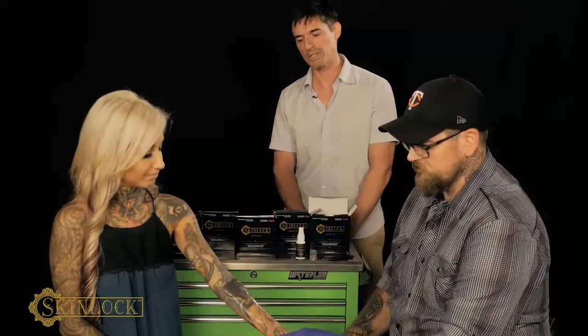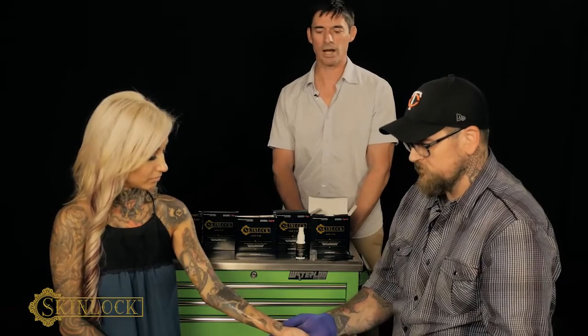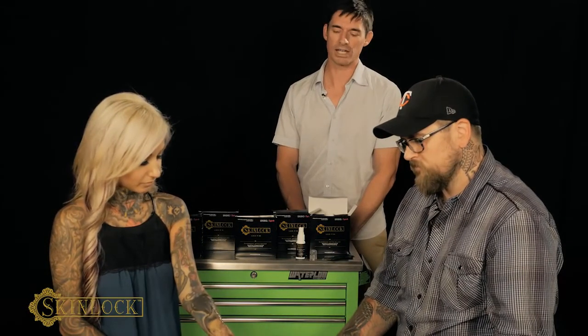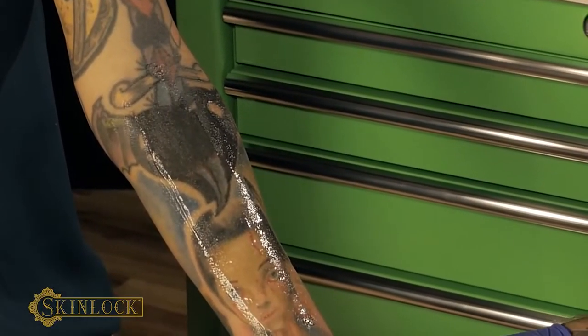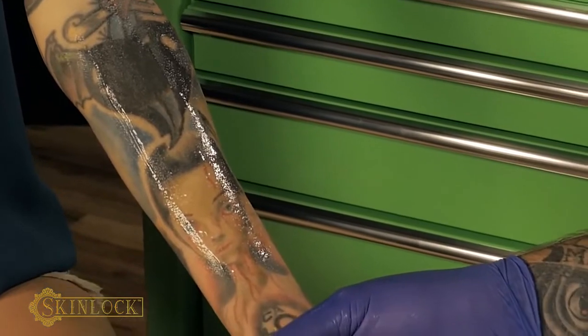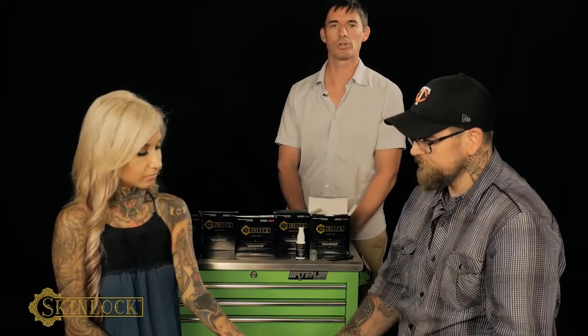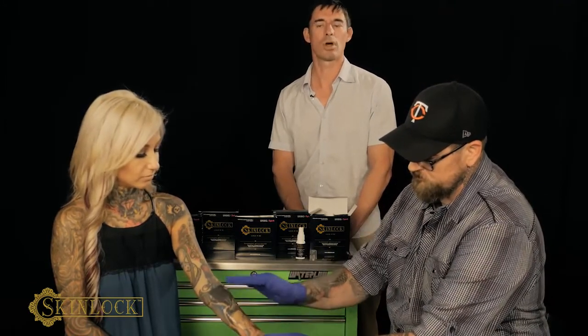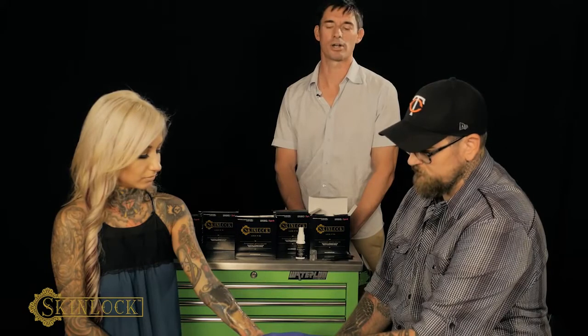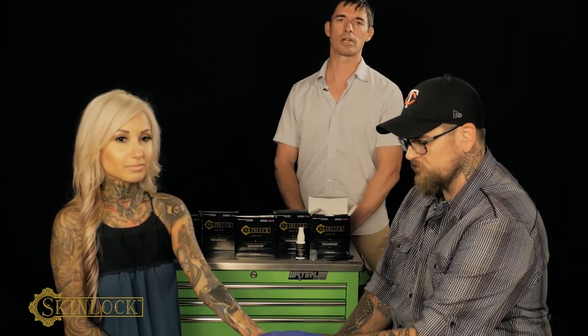So Bernadette would keep this on for 1.5 to 2 hours. Maybe if you had a very dense tattoo with a lot of fill on it, maybe keep it on for 3 hours for something that has a little bit more bleeding and a little bit more exudation. But otherwise, at the end of 3 hours, she would go home, put this under cool water in the sink or the shower, and just gently allow it to rub off in the water, and then go to whatever the artist recommends as a typical aftercare product.